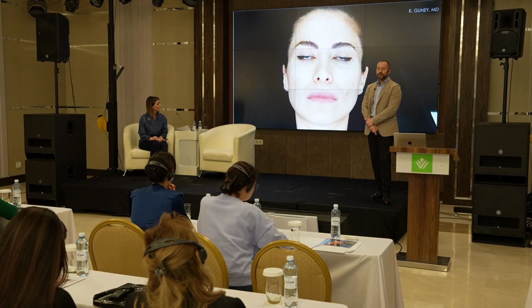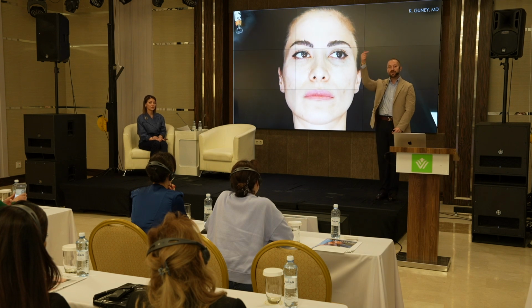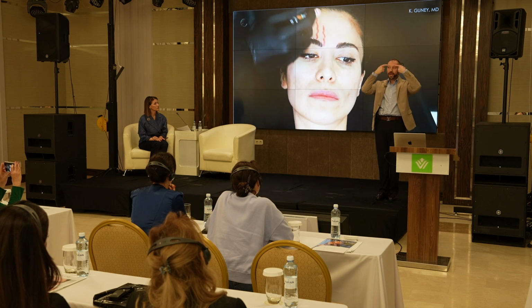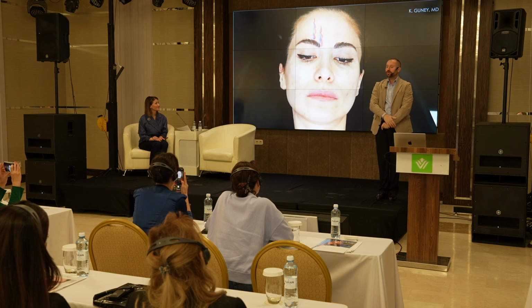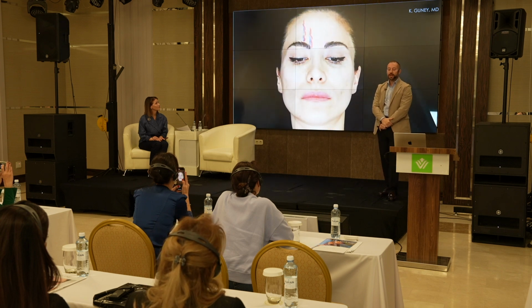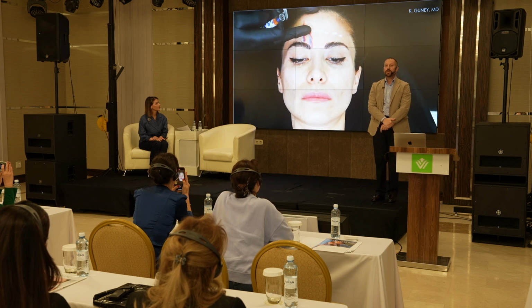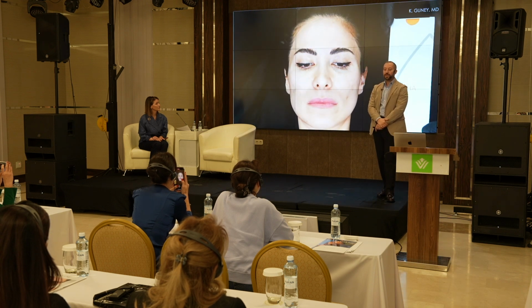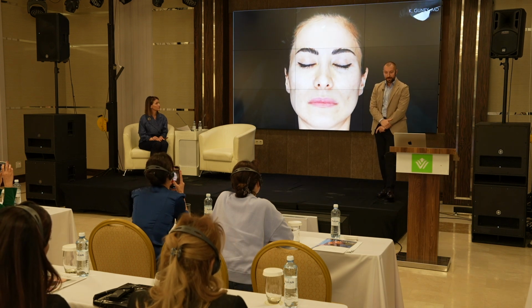But it's better to inject with a cannula. With cannula injections in the forehead area, you can use an entry point from here with this technique. Also, you can use 2 entry points, or you can do 3 entry points. It doesn't matter. Entry points are not so important, but the important things are safety first, and the depth. These are the arteries, supraorbitalis and supratrochlearis, my safety line, and I show my entry points. The product is RH3. Sometimes I use RH4 also for deep injections in this area.